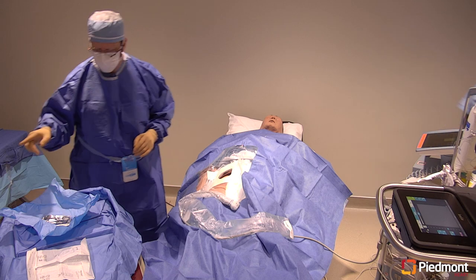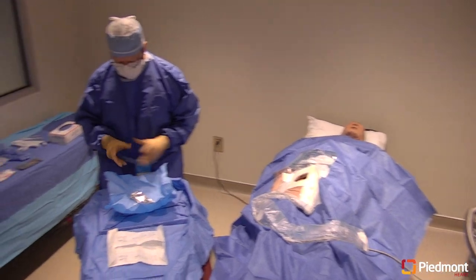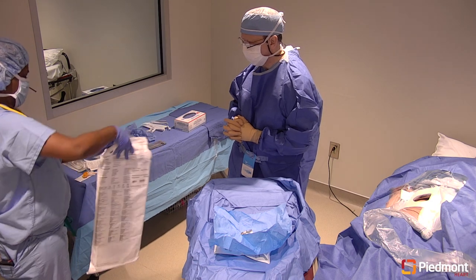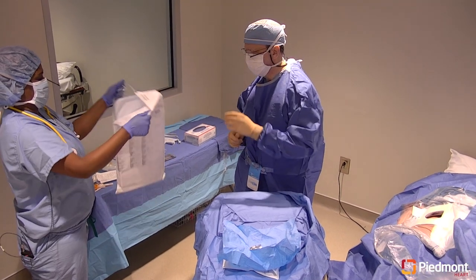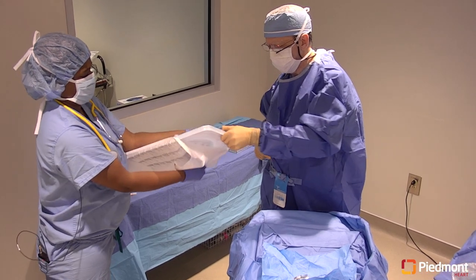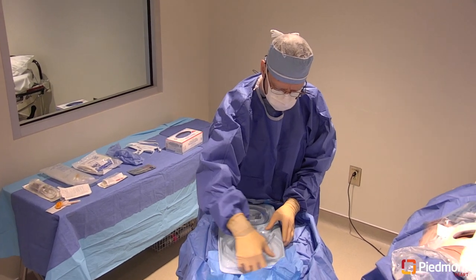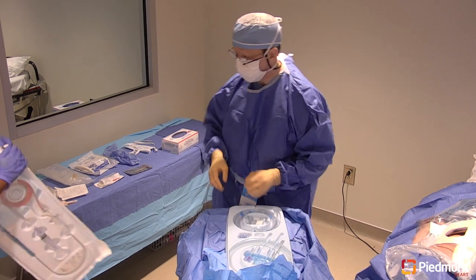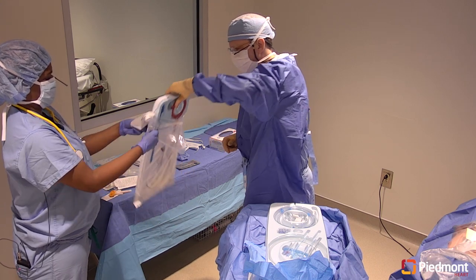Okay. Now can I have the first tray out of the kit? Nancy will now provide the inner contents of the balloon pump kit. Are you ready for the second? I can take it now, sure. Do not touch the inner contents of this peel pack.